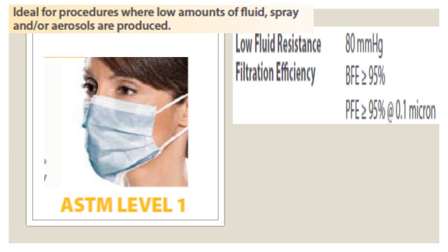So this is the mask we use in the outpatient departments, and American Society for Testing and Materials standardization has given different levels of exposure, and here it is ideal for outpatient consultation where you see the patient at a distance and the probability of the fluid spray is very less. This has a very low fluid resistance of only about 80 mmHg, but a decent particle filtration efficiency of 95%.